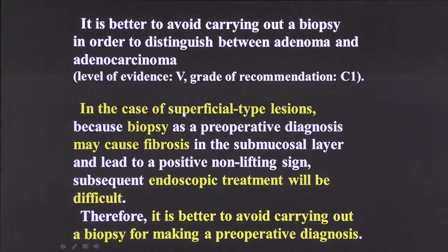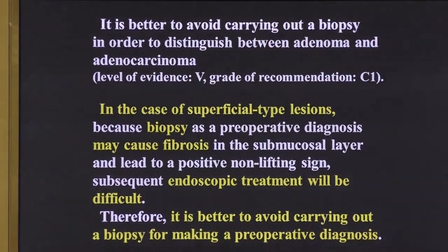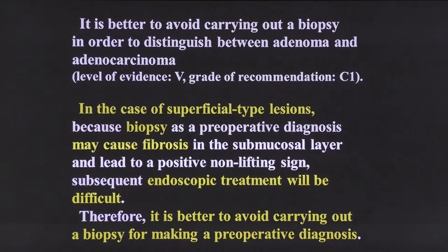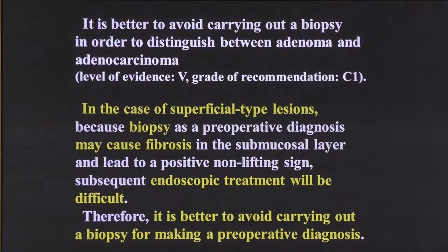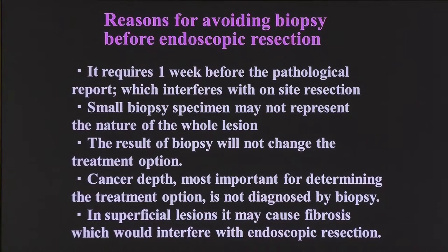So our recommendation says that in the case of superficial type lesions, the biopsy may cause fibrosis and endoscopic treatment will be difficult. Therefore, it is better to avoid biopsy for making a preoperative diagnosis. Preoperative diagnosis means pre-treatment for EMR or ESD, not surgical operation.